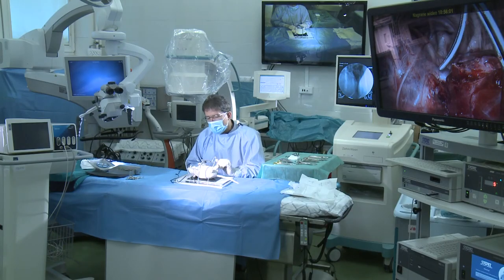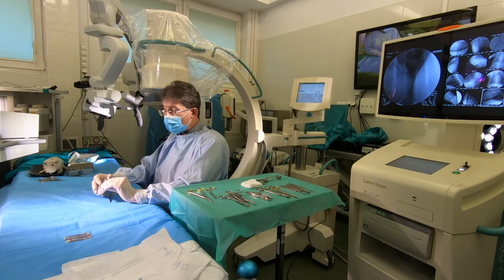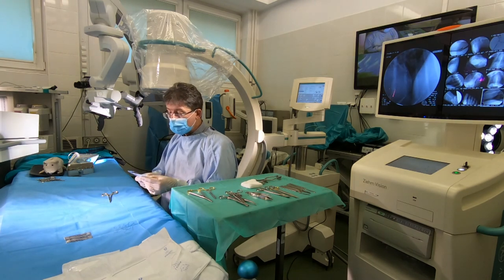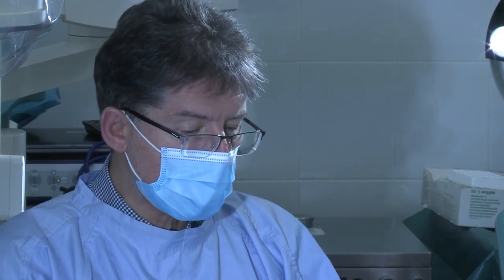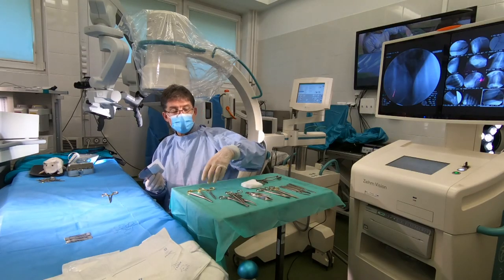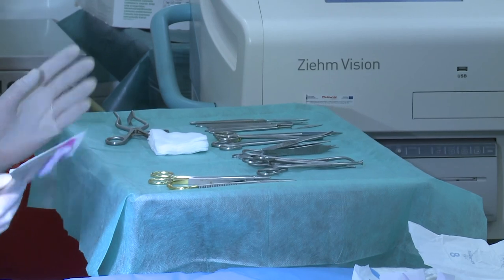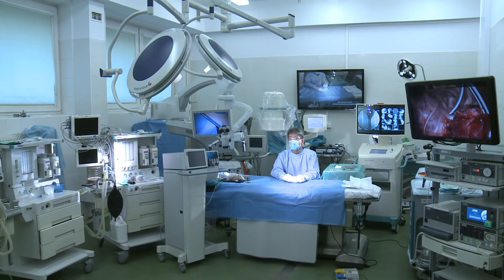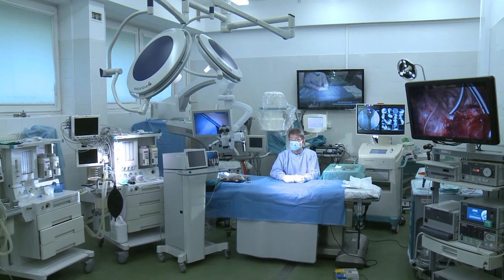All these sutures are placed, of course without the external cover or external envelope, here on the table close to the needle holder. And then we have the whole surgical table ready for use. That is all for now, and I will welcome you for another part of our short training course for the next parts regarding experimental surgery. Thank you.